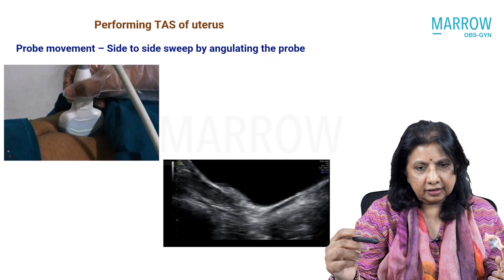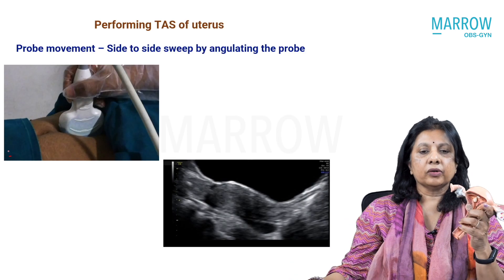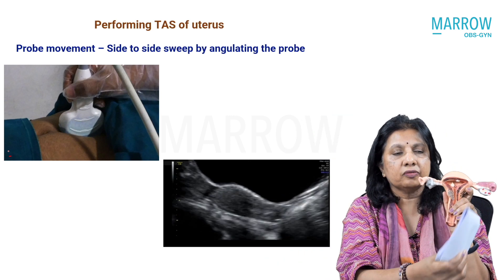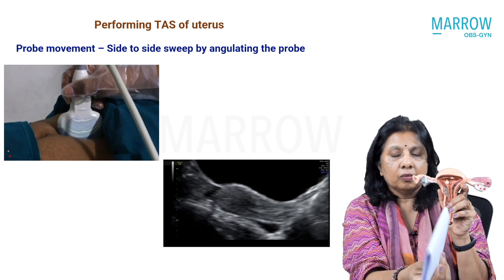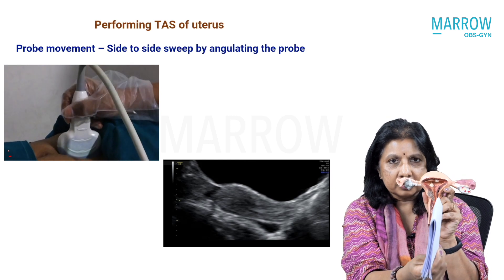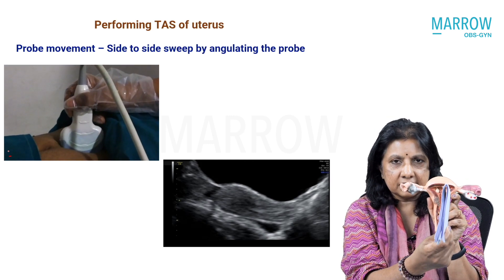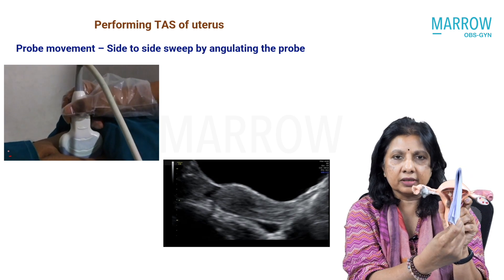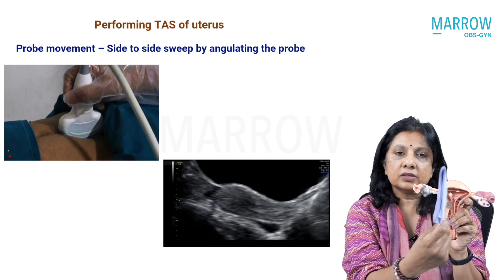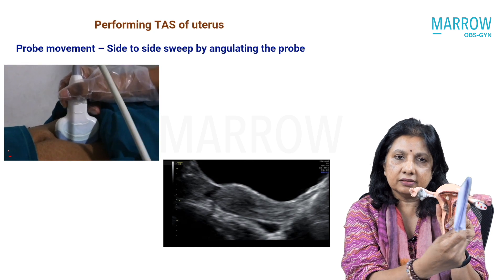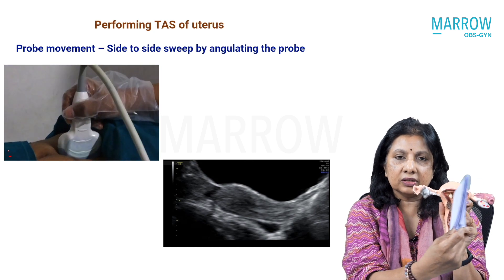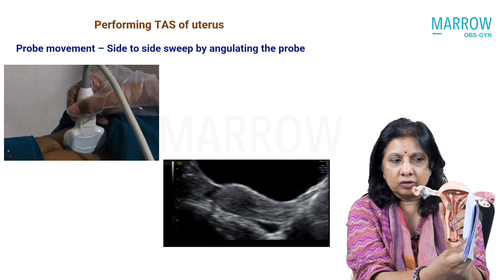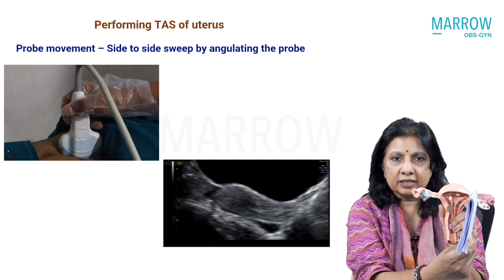As you can see in the clip, I am doing a side-to-side. When my probe is like this, if I were just staying stationary, I would only pick up the anterior-posterior slice of the mid uterus. But I need to see the margins — what is on either side of the midline of the uterus. So because of that, I do what is called a side-to-side movement.